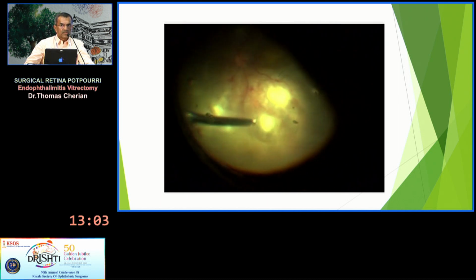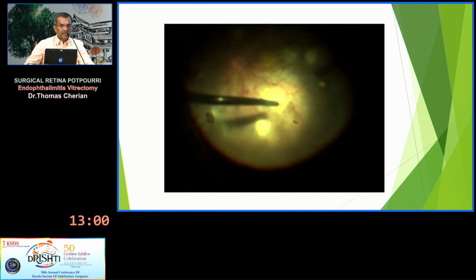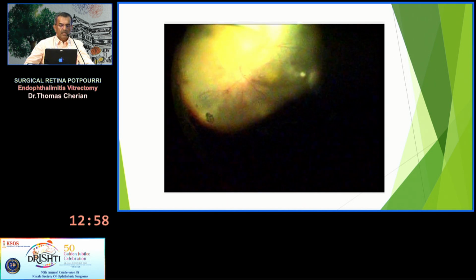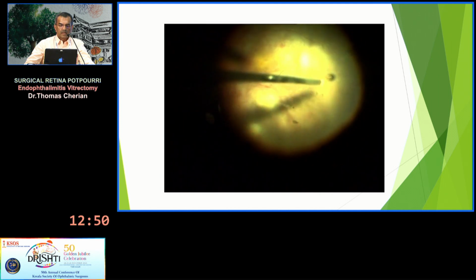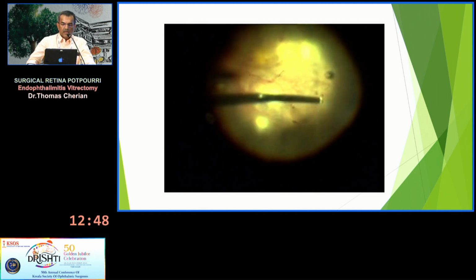There are a lot of exudates on the retina. It might tear any time. Do a good dissection, clear up wherever possible. And once you clear, your vitrectomy is done. The next question is whether to inject oil or not.